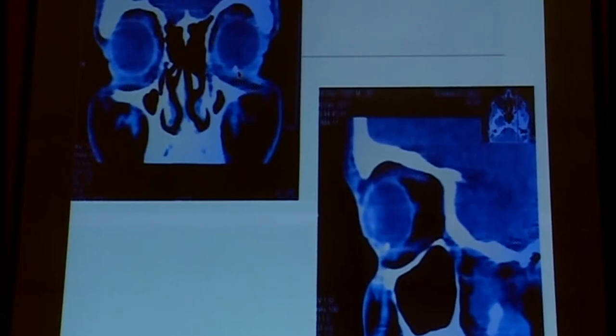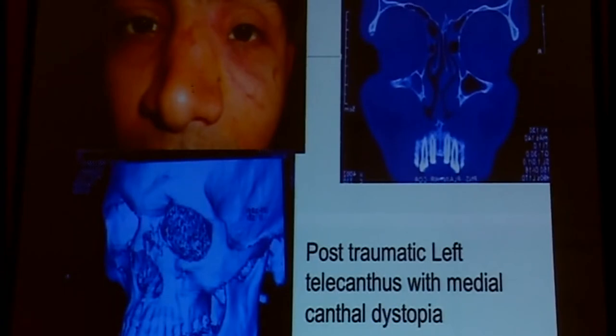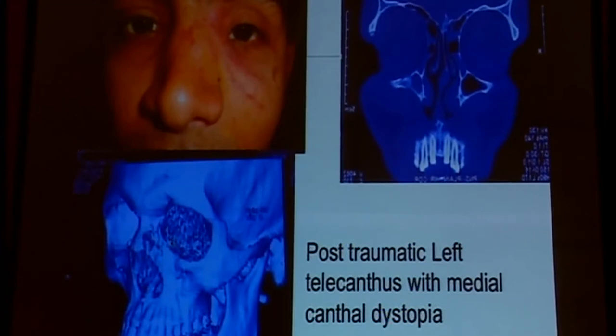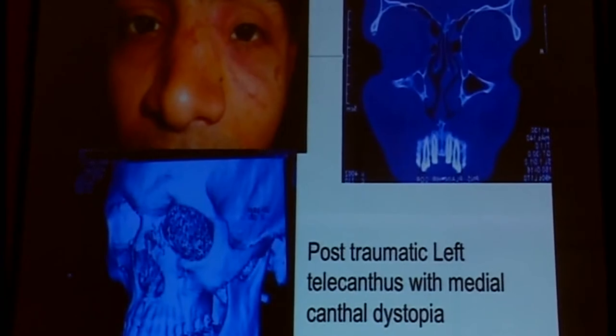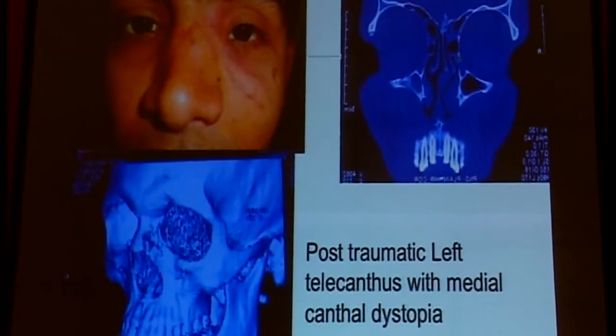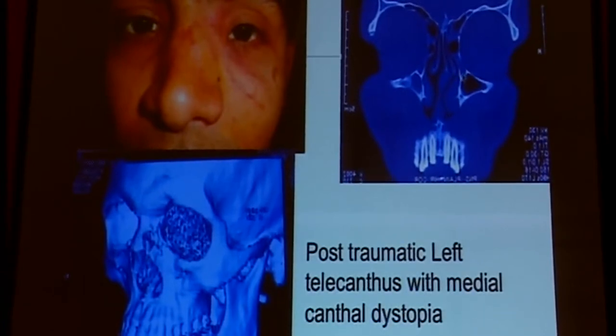In another case, an X-ray was done - nothing much picked up. We did an ultrasound - nothing much picked up. We got a CT scan done and there was a foreign body. If the foreign body is lying just embedded into the coats, it can be missed by ultrasound. For lacrimal patients coming in for DCR and medial canthal reconstruction, you need 3D CT images so that you know exactly what you are dealing with - whether you would need a burr because fractured bones get malaligned, and a mechanized drill may be required to create an opening and also to check whether your nasal cavity is roomy enough.